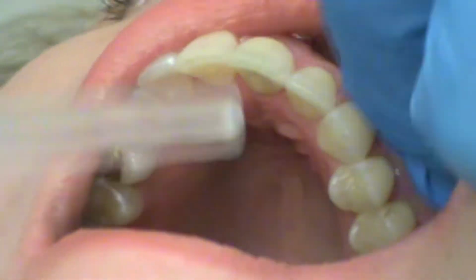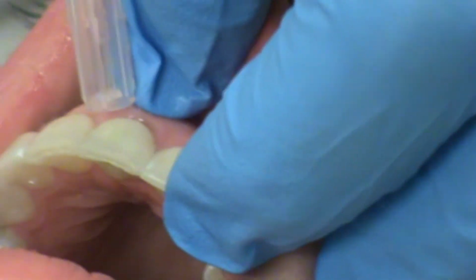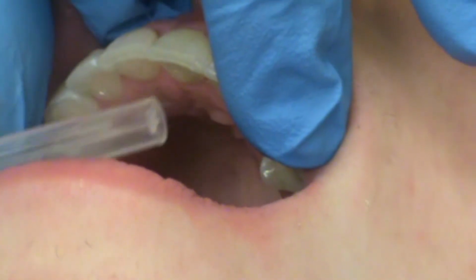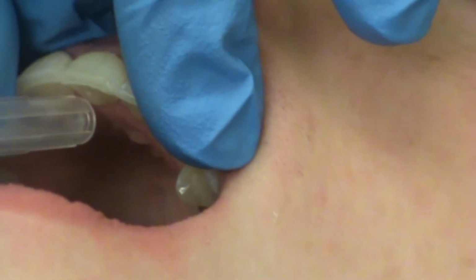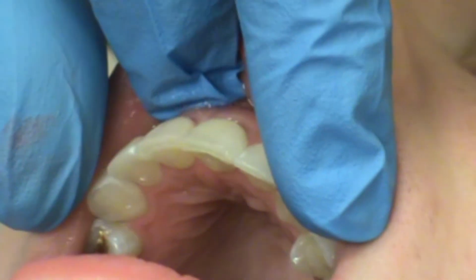Or to numb this up, we come out here and we inject just a little bit under the foramen here, under the frenum, so that the tissue is nice and soft and absorbs anesthetic easily. That gets her numb. Then we can inject right here between the two centrals and slide it forward just a little bit. And then you'll see the papilla between 8 and 9 turn white. It'll be a little blanched, and then wait for a moment. Then you can inject right here, and the entire nasopalatine nerve will be numbed up. Takes 3 injections, hurts a lot less.